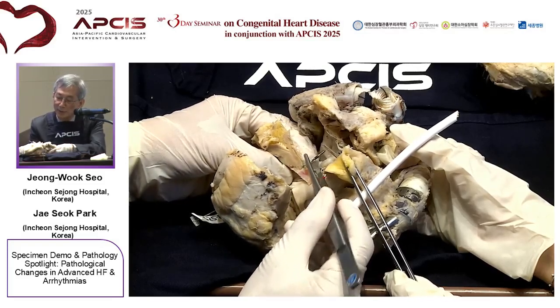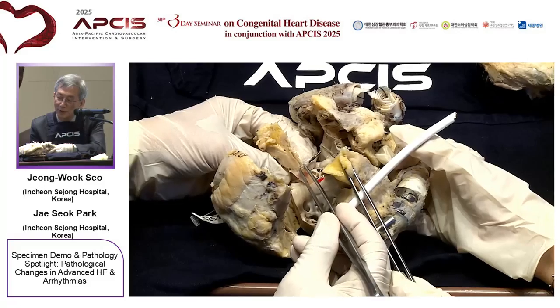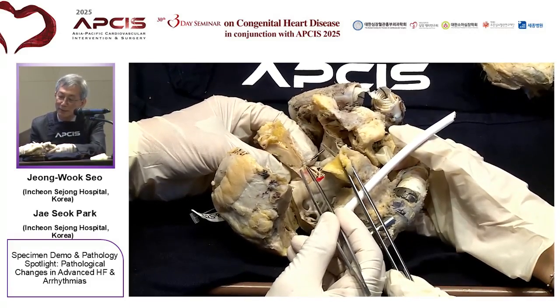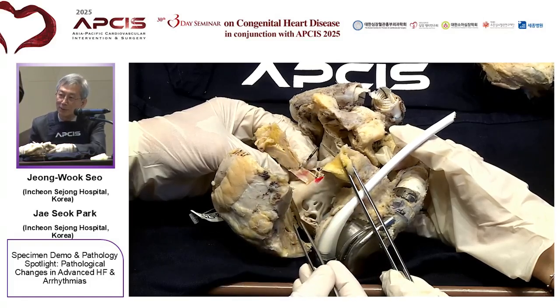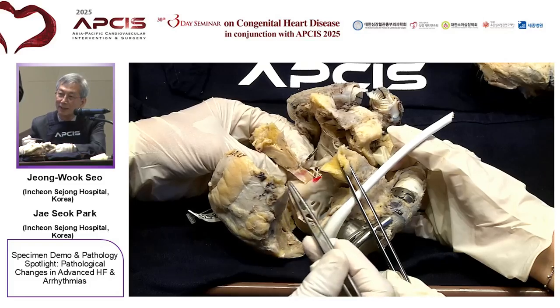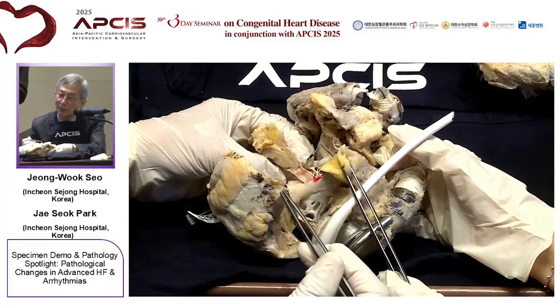But I could see the CSP lead penetrated only one third of this septum. Dr. Park Jae-seok said that in this particular patient, the ICD lead was already placed through the left subclavian vein. Then the second CRT lead was tried but failed.